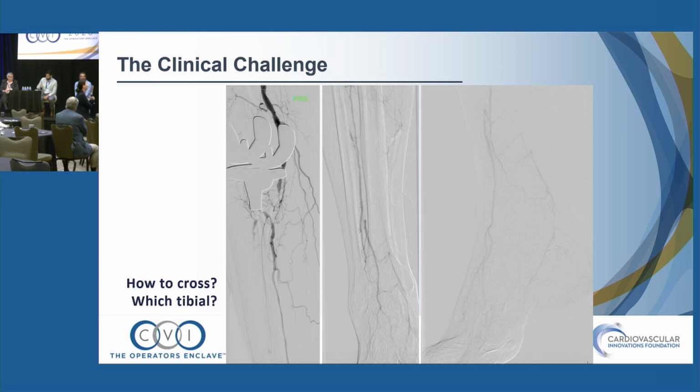This was a relatively urgent add-on. His foot was not doing great, so we ended up bringing him to the cath lab within a couple of days. I don't think that's unreasonable. If it's critical limb ischemia, and it looks very clear that it is, you need an angiogram. If you have a popliteal pulse, you know it's going to be all below-the-knee disease, so you could go straight to a diagnostic. It's sort of like getting a stress test prior to a STEMI, where you know what the diagnosis is. But I think it's different because, at least for my partners, there was the same mentality: stress test versus taking them to the cath lab.